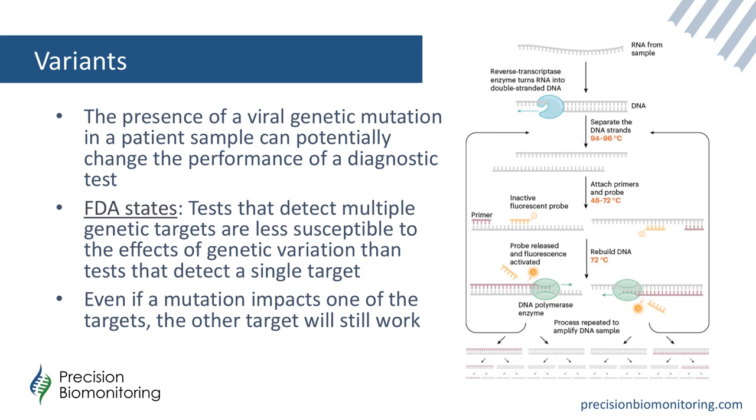Now, that said, it's not an impossibility, and tests should incorporate a way to screen for impact to their test by looking at new sequences from new variants to see whether these mutations are present in these primer and probe binding sites.